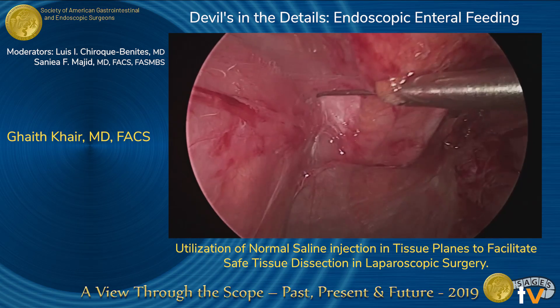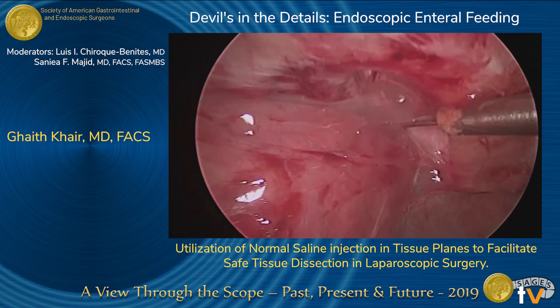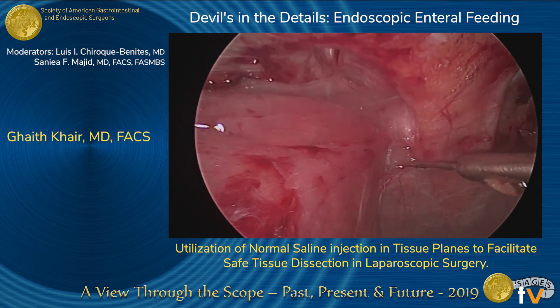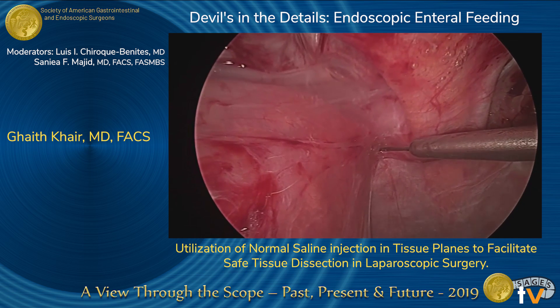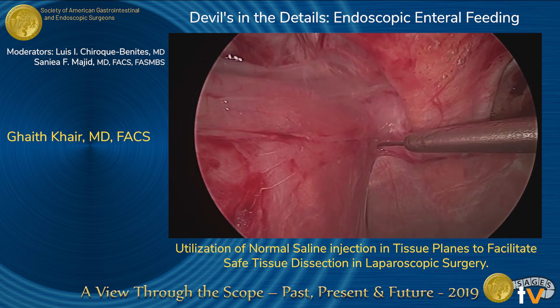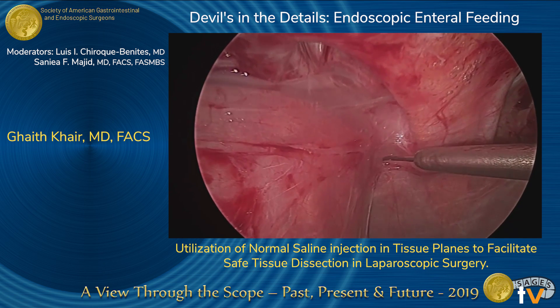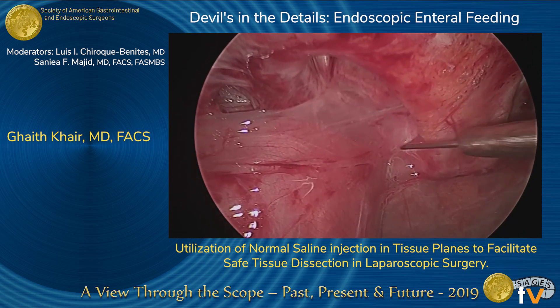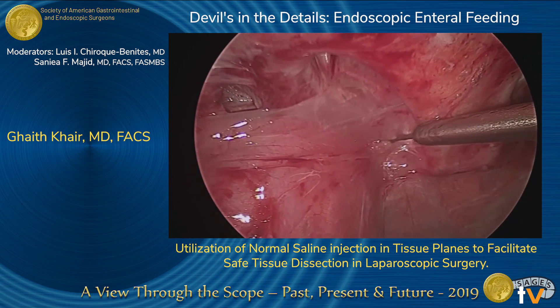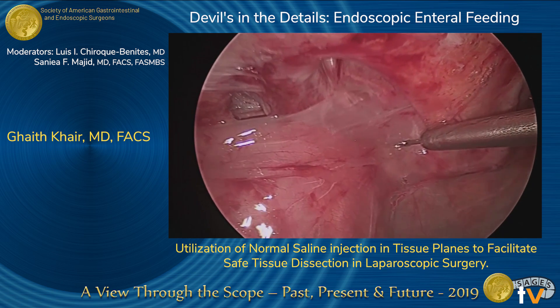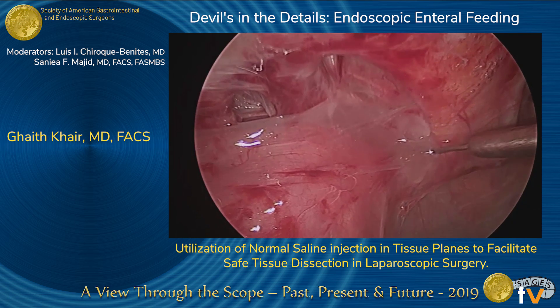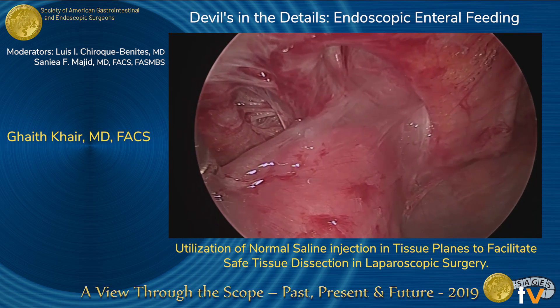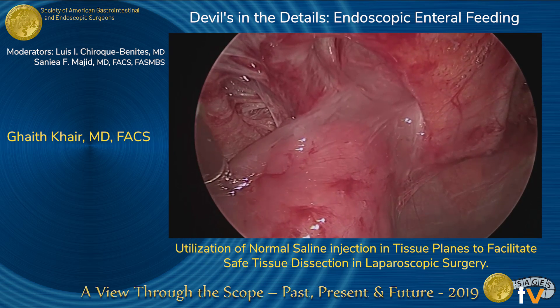This technique can also be utilized in difficult gallbladders, in areas where dissection is tedious and difficult. I have utilized this technique even in open operations where extensive lysis of adhesion is needed. It helps us in identifying the plane between the two loops of intestine.